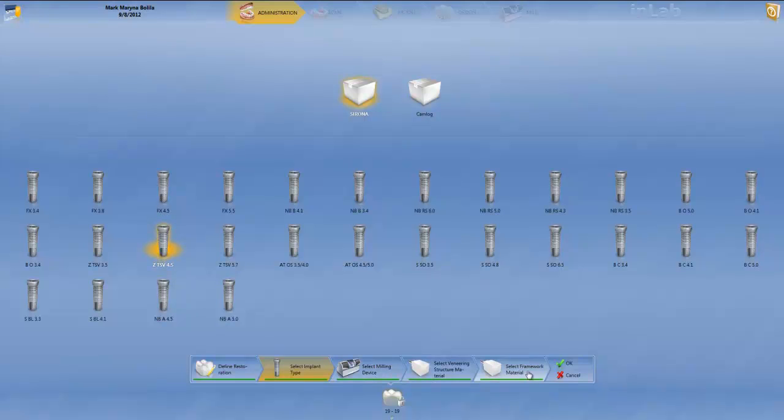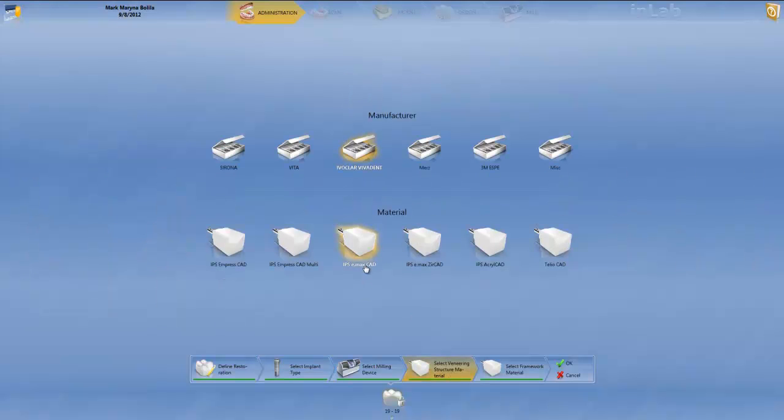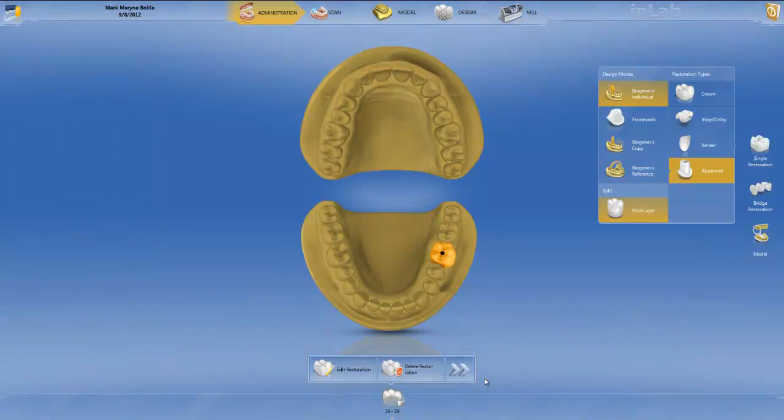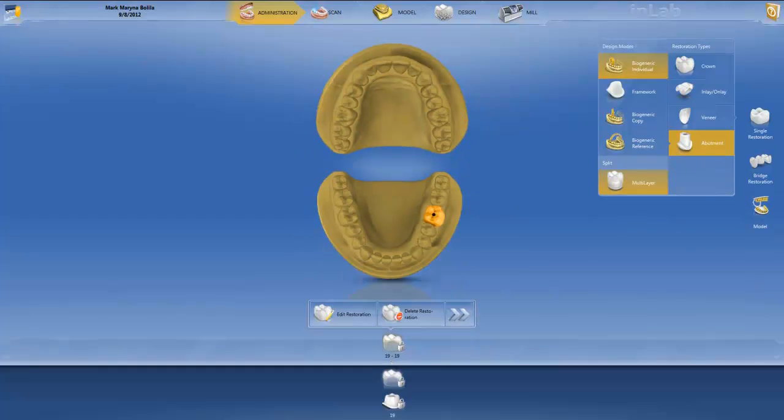There are two structures in the middle. We're going to use a Veneer, meaning the top portion goes on top of the abutment. You have to choose the material — in this case we choose e.max Crown. For the framework, we only have one choice: Zirconia by Sirona. We click OK, exit, and again verify that you have two restorations at the bottom before you proceed.